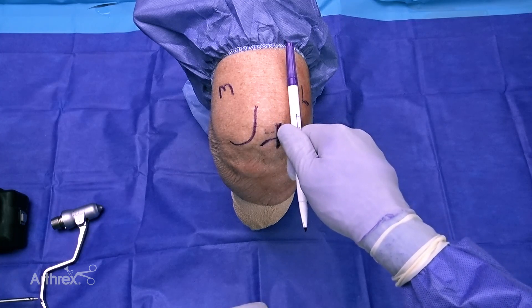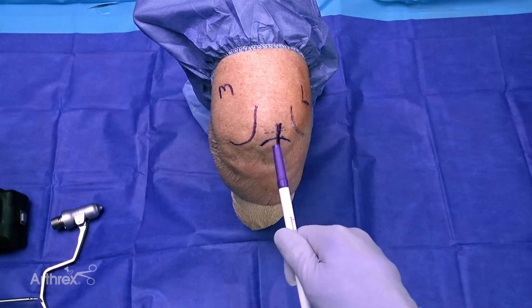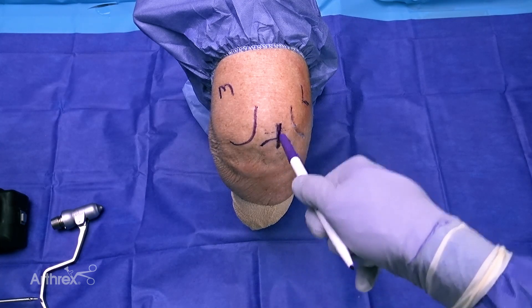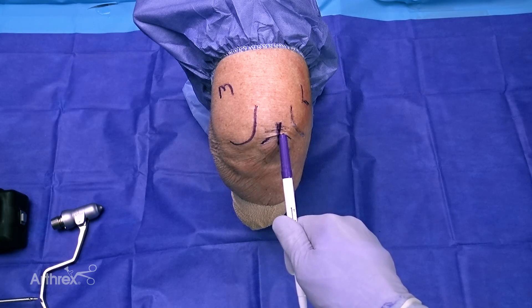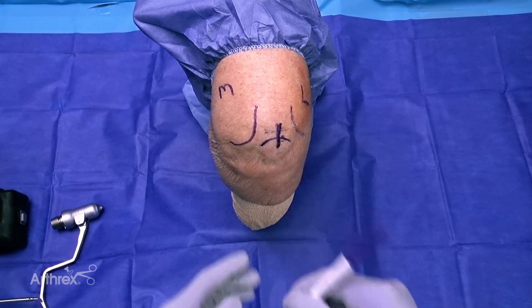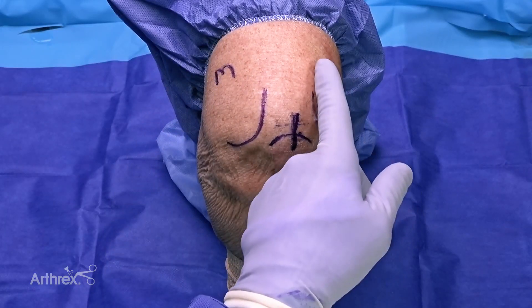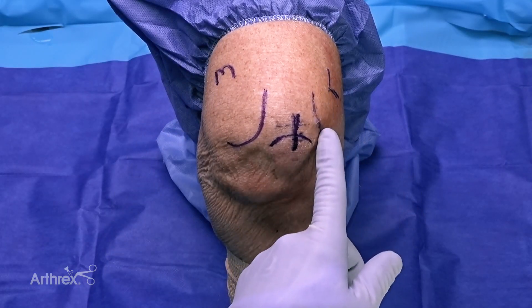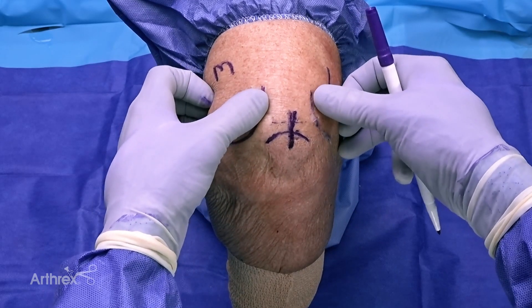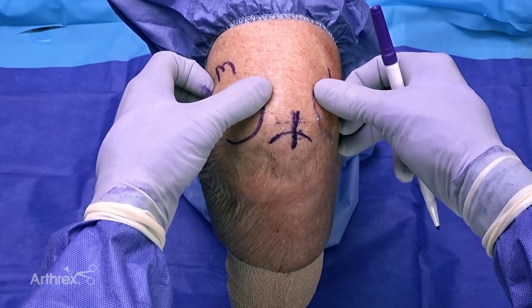If you are too close to the patella with your incision, you have to work around it, drop your hand, and can sometimes actually hit the superior pole of the patella. So I always place my transverse soft tissue incision about one centimeter proximal to the superior pole of the patella. I also like to mark out the VMO and the border of the vastus lateralis, which you can palpate readily to feel where the quadriceps tendon is running.